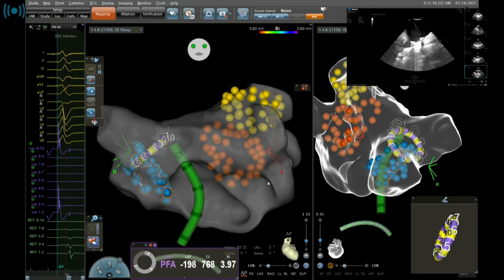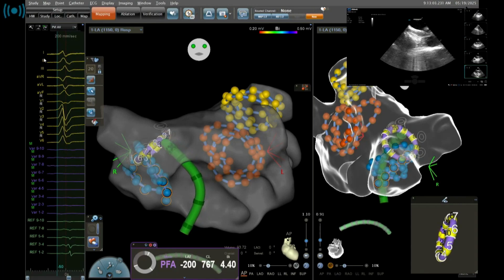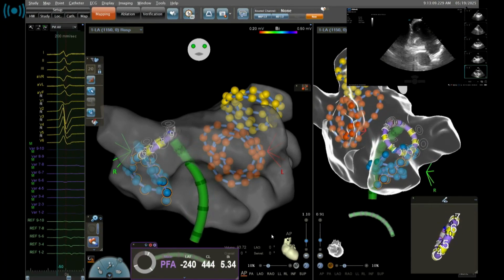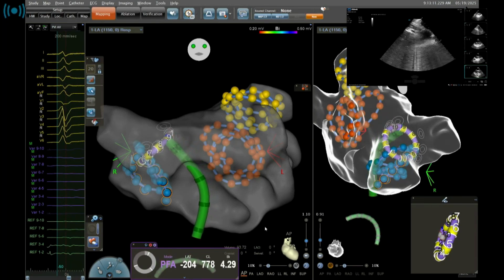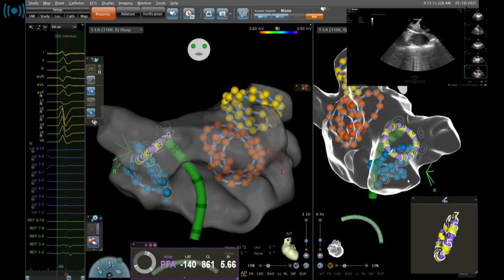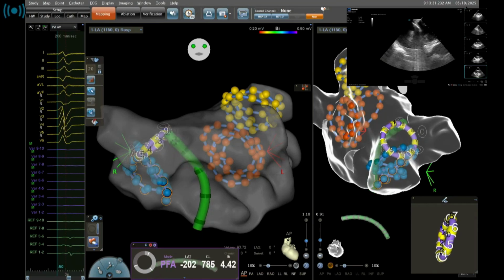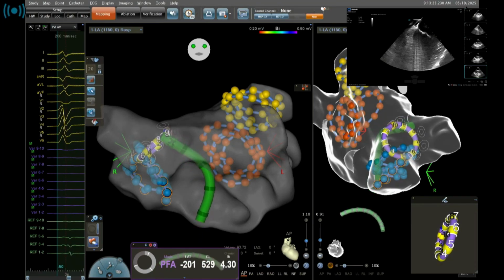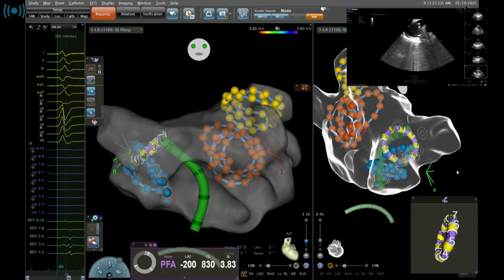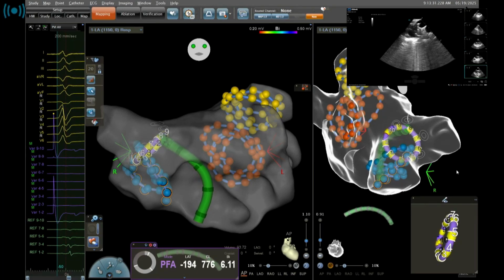Okay, now we are. No, we are not inside. I try to find a better position. It is a little bit small. In this patient, the right superior is smaller than inferior, because of the position of the heart. So sometimes in young people, the superior vein is really anterior, so you have to rotate more. Now we are here. You can see on the echo. Is it good for you, Janka? Yeah, I think it's good.